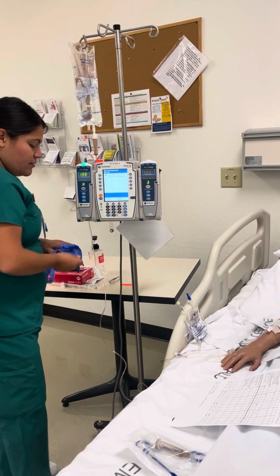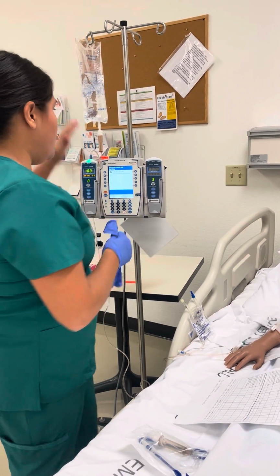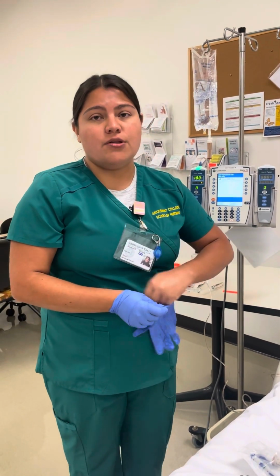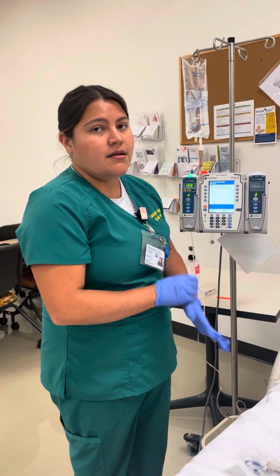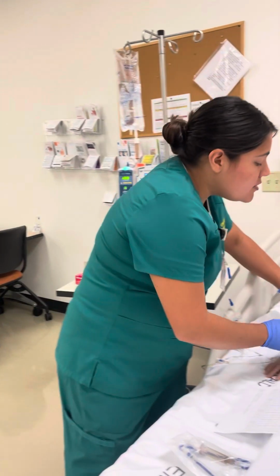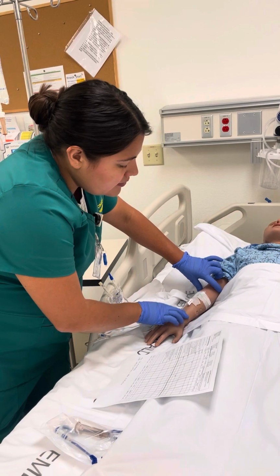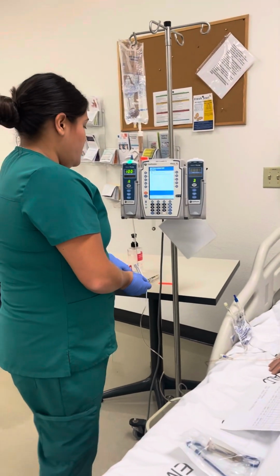Putting on gloves, performing hand hygiene. Even if it's running and I have normal saline, because it's IV piggyback, I would check for compatibility between the primary and the antibiotic. Cefazolin is compatible with normal saline. And I'm checking for any infiltration or pain in the area. He doesn't have it. Okay.